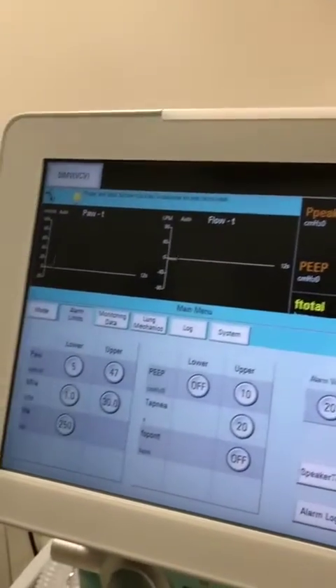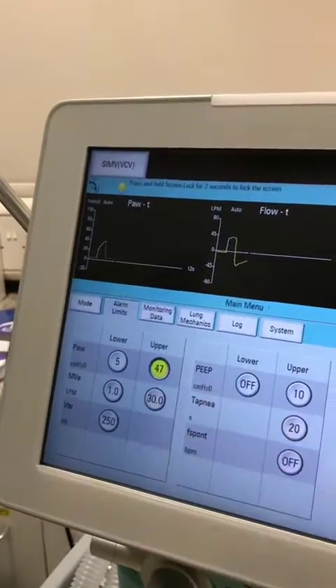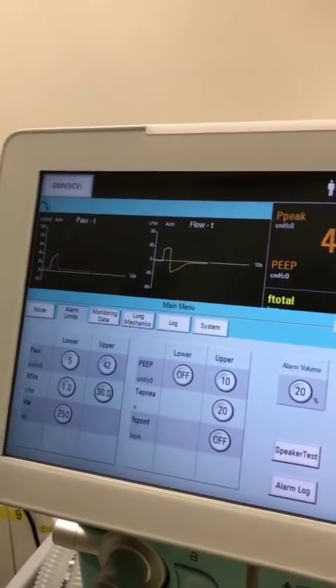For alarm limits and changing your alarms, do the same again — all touch screen — and click to confirm.